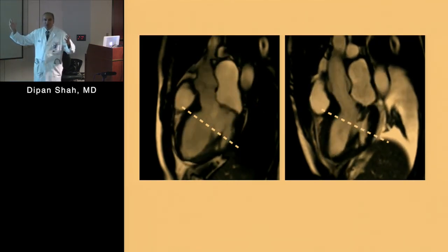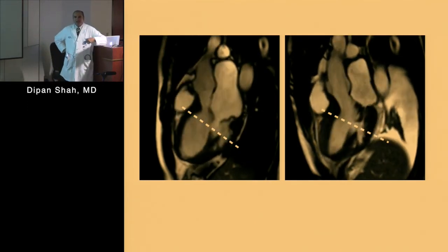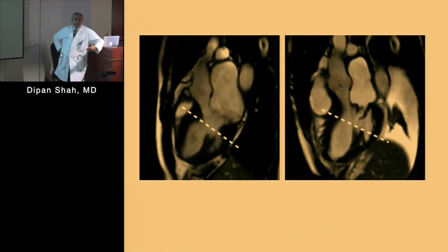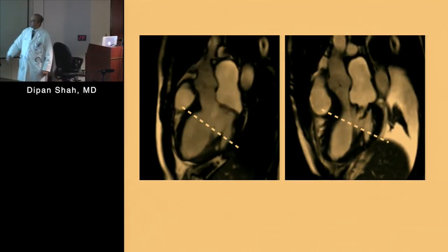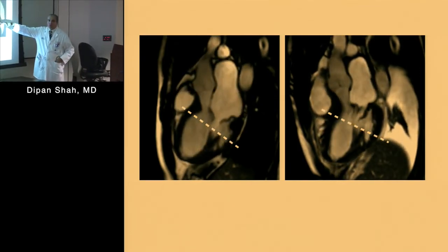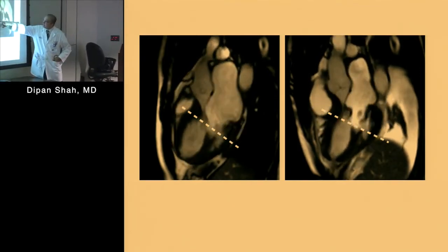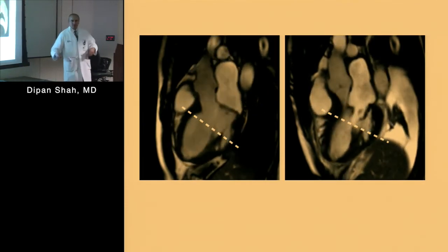Now, again, we don't know. This is one of the things that we're interested in looking at, looking at these patients after surgery to see what happens to them. But at least I could hypothesize, based on this one anecdote, that maybe by doing surgery, you may alleviate the stress on this papillary muscle, and maybe that could prevent the formation of fibrosis, but nobody knows.